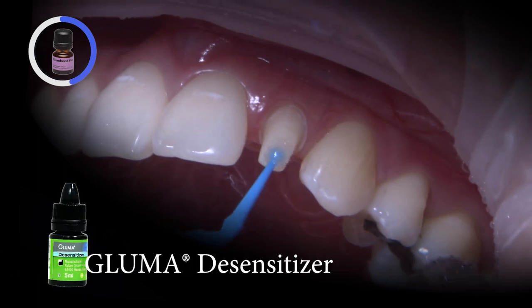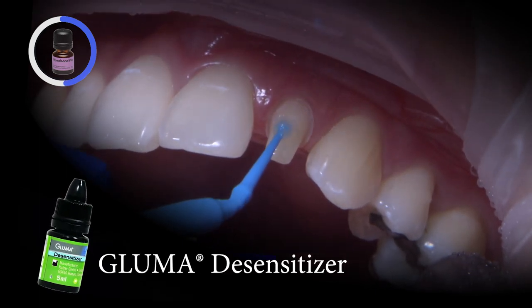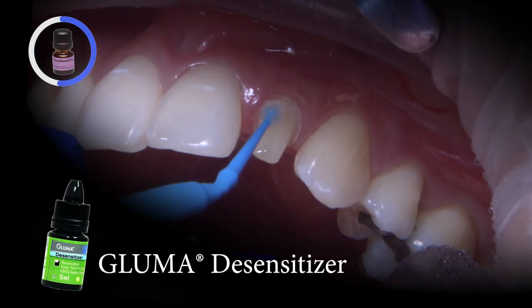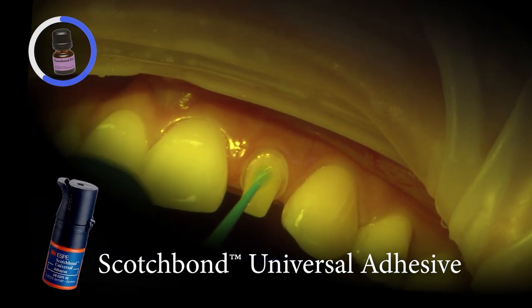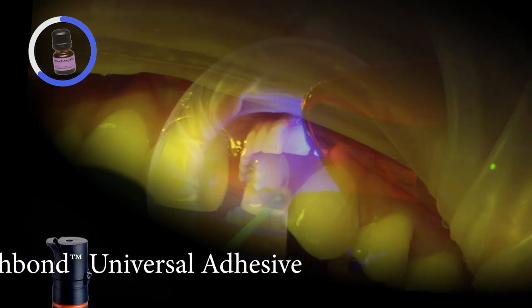I desensitized with Gluma to seal the dentinal tubules and to provide an antimicrobial effect. It also helped wet the tooth to prepare for the 3M Scotch Bond Universal Adhesive Agent, which is thinned out and light-cured.